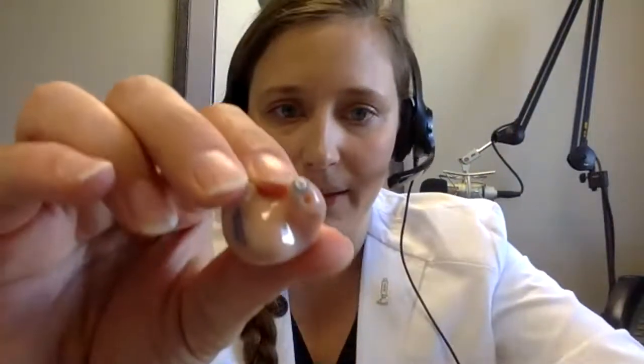Okay, if it's still not working, and you have a hearing aid like this, so yeah, this style, right? These all have little filters built into them. Some in-ear monitors even have that as well.